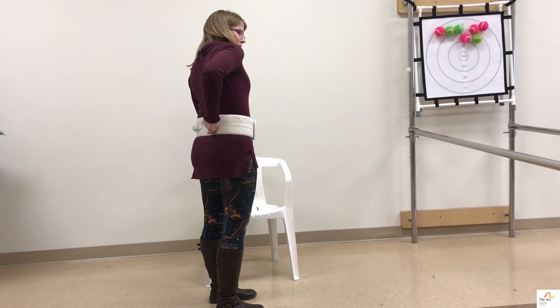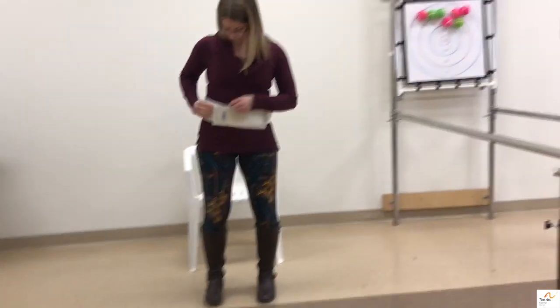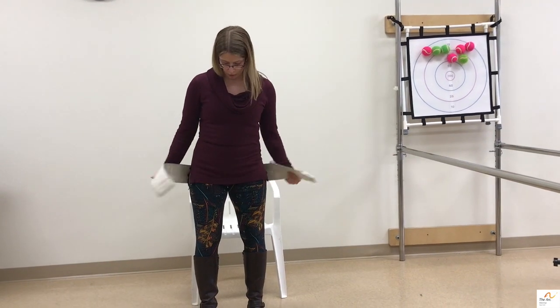You can also grab the handles that are sewn into the back right here. You don't want to put a gait belt up underneath someone's armpits or below their hips, as this won't provide you with the best support when you're ambulating with someone or assisting them with a transfer.